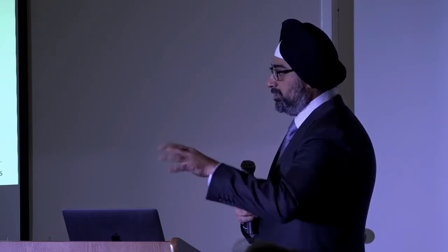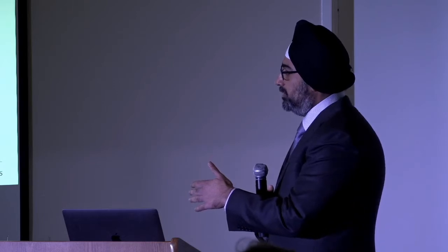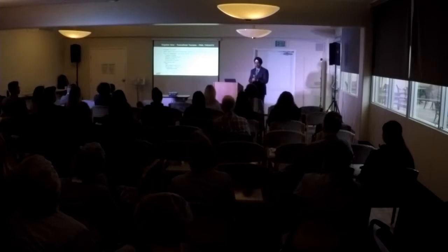But at least from an edge-to-edge repair or a clip standpoint, based on our experience with the mitral valve, we know that it's safe. There's a very high implant success rate, and that has carried over to the tricuspid valve. TR reduction, I think, is going to be important if we're really going to have a meaningful impact on our patients' lives. It can't just be a one-grade TR reduction. It has to be more. It has to be a surgical-like result, right?